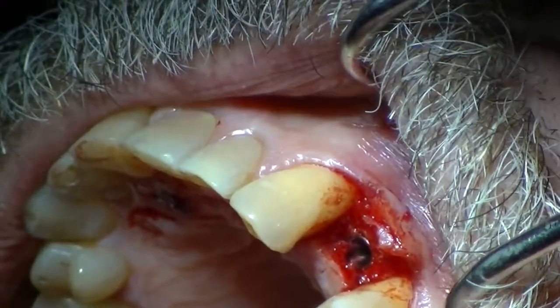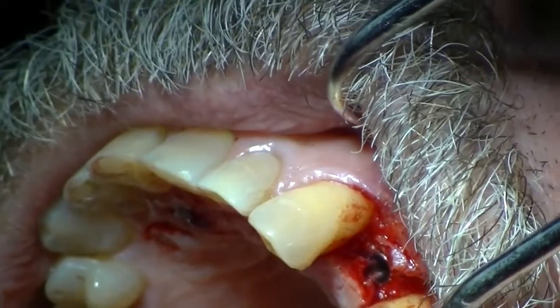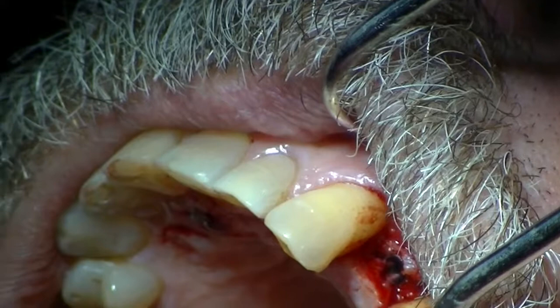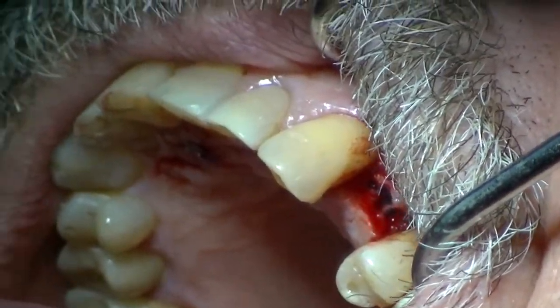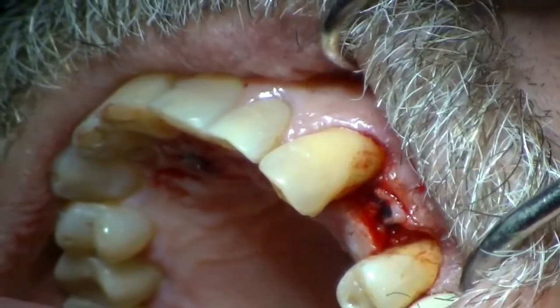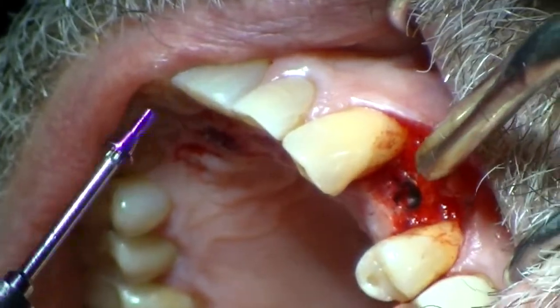Now to simplify things for our patient, as far as transitional, because we did get to 35 Newton centimeters, certainly we could put a healing abutment in, but I'm going to go ahead and put a flat cover screw in that site and then suture it closed and let it heal so he could wear his transitional.